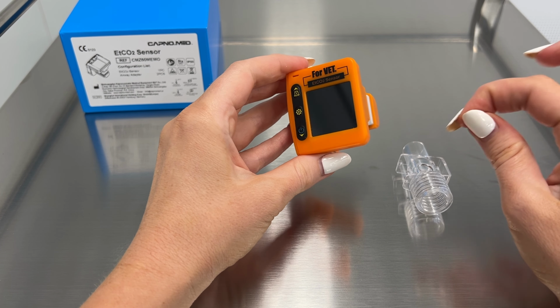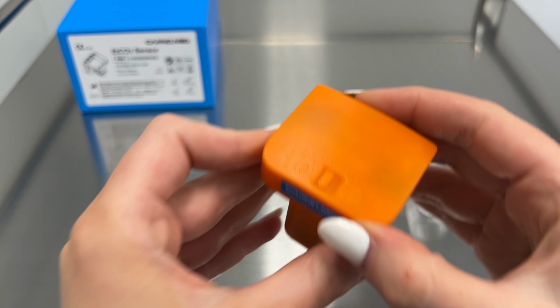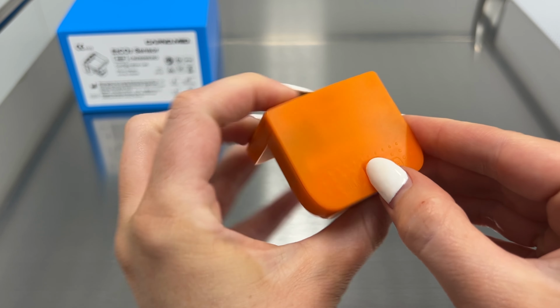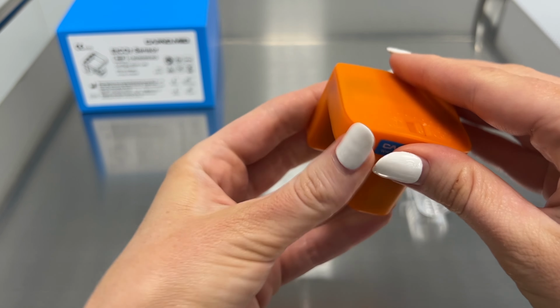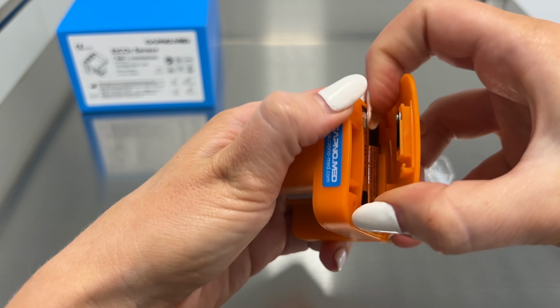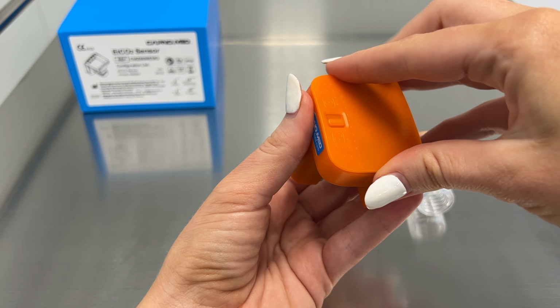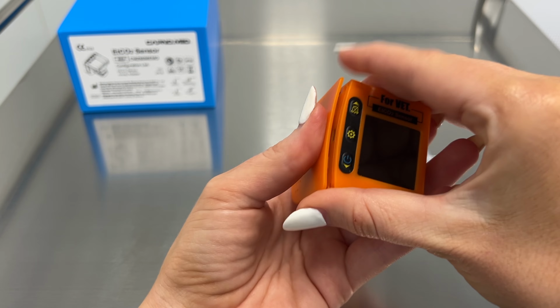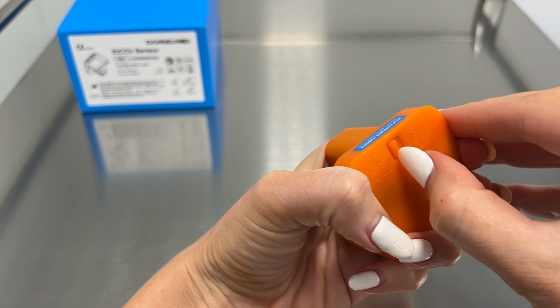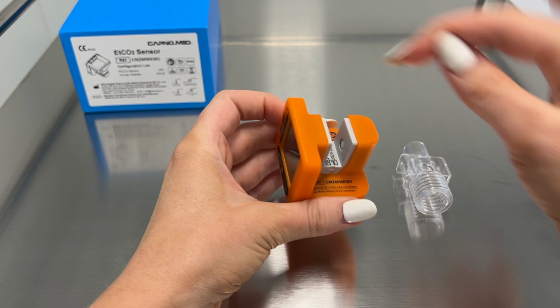First of all, you will need to place two AAA batteries into the back of your sensor. I've already installed them into this one, but you just need to unlock, so clipping this little clip over to the right, and the back of the sensor will just clip off, and you can insert your batteries like so. And then placing the back on, and we're going to lock it in place as well. Lock it again.